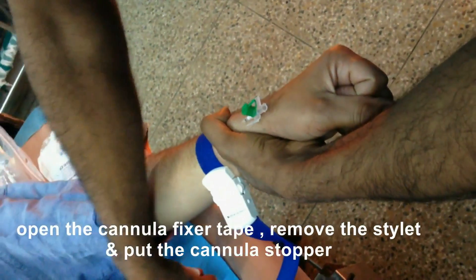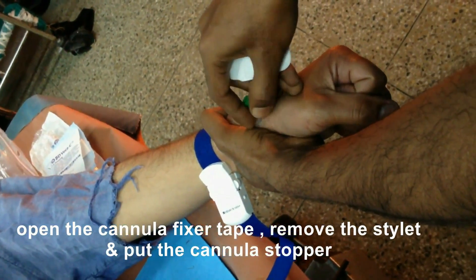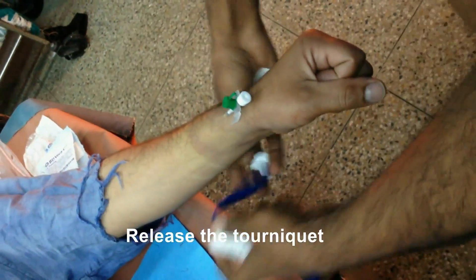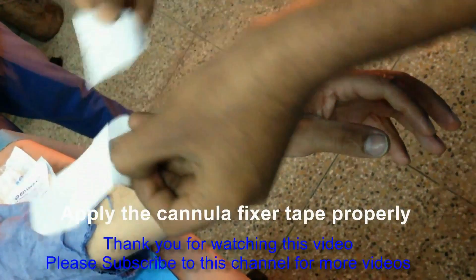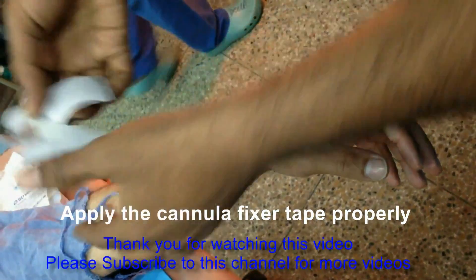Now take out the stylet and put the cannula stopper. Make sure your easy fix tape is ready to fix the cannula. Now release the tourniquet and apply the easy fix tape.